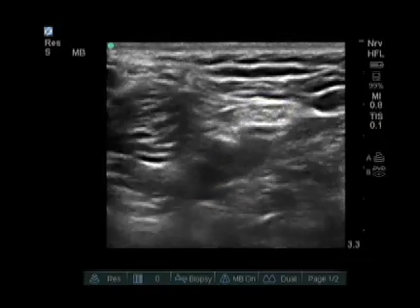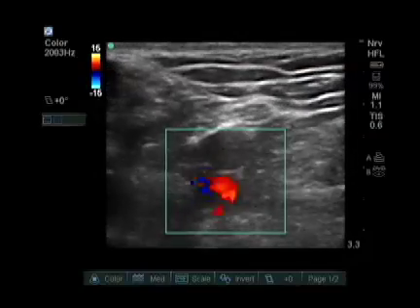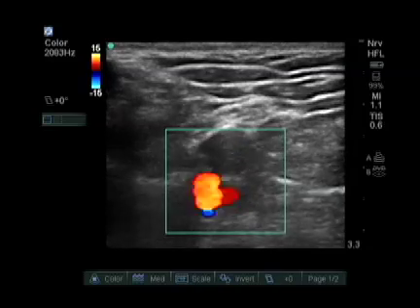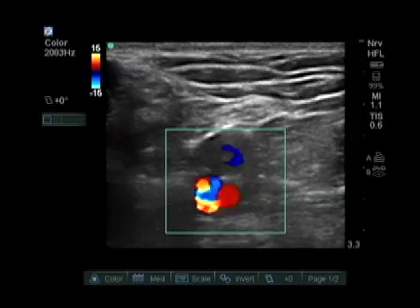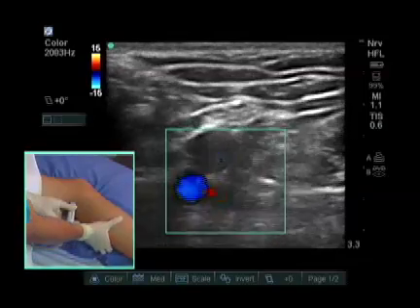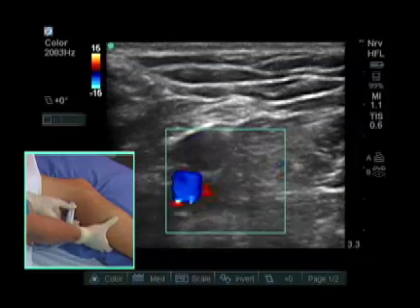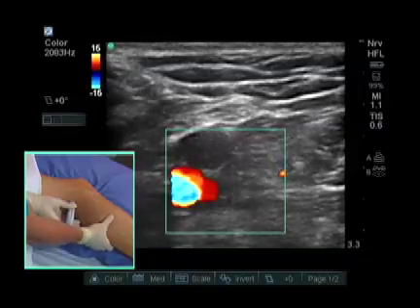If we put color Doppler on the screen we are able to see the pulsating artery in this area. Sometimes it is difficult to see the popliteal vein because this is a low flow state, such as we see here. To visualize the popliteal vein better, we can squeeze the back of the calf, increasing venous flow through the popliteal vein. There we can see increased venous flow through the popliteal vein represented by color Doppler.